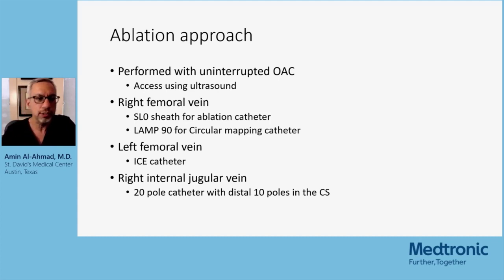I think Luigi does the same, mostly for stability, catheter stability, if you want to map a flutter, and also in case the catheter's not banging too much when you're on isoproterenol.